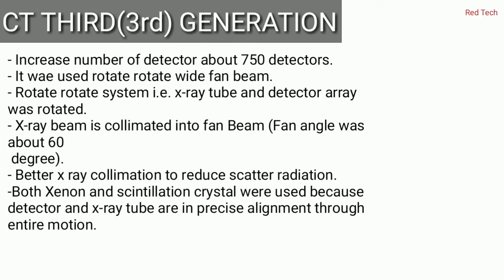So the second generation we call narrow fan beam, and in third generation we use wide fan beam because the fan angle was greater than in the second generation. But in the case of first generation, there is no fan beam, so we call it pencil beam.